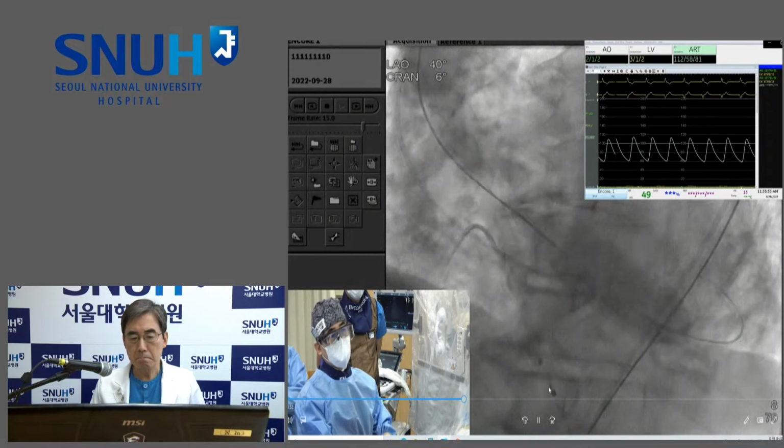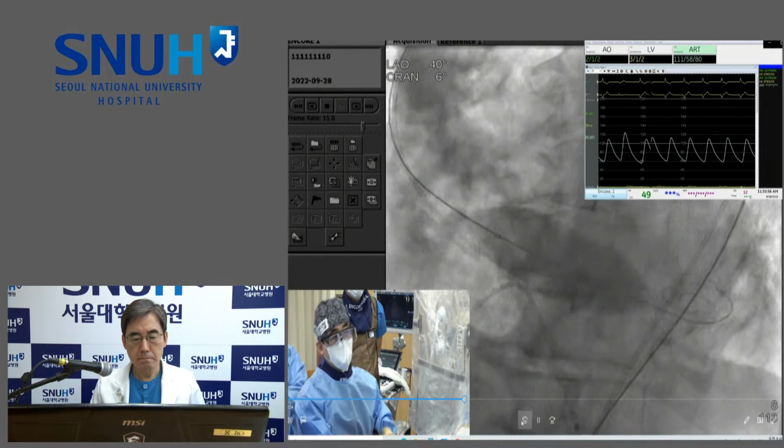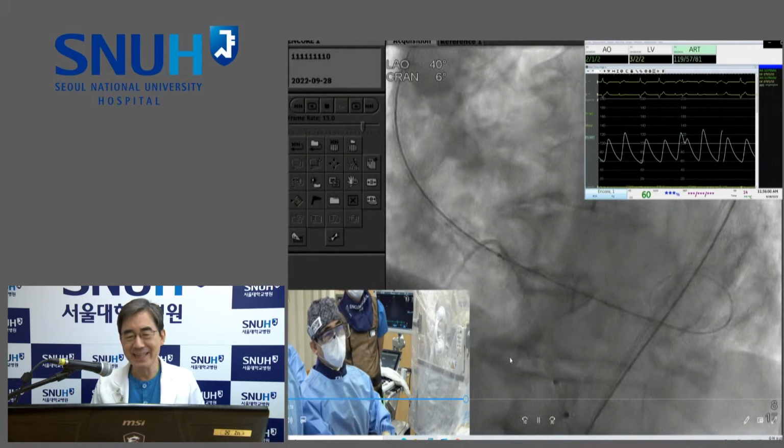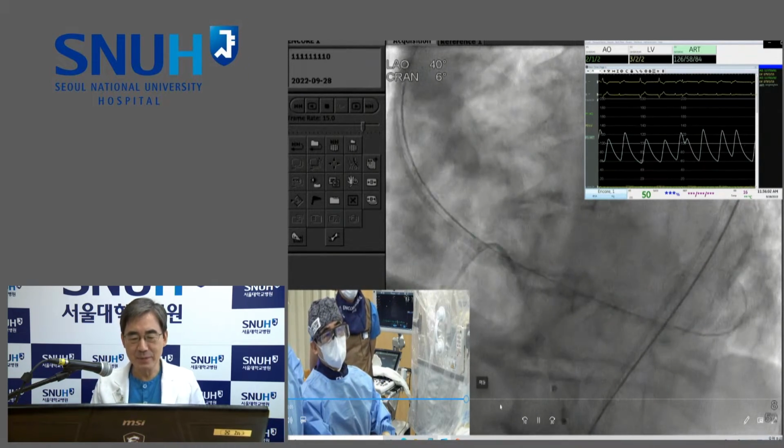So in the video, you don't use rapid pacing for the predilation? No, I did rapid pacing, but capture is not complete. Okay.